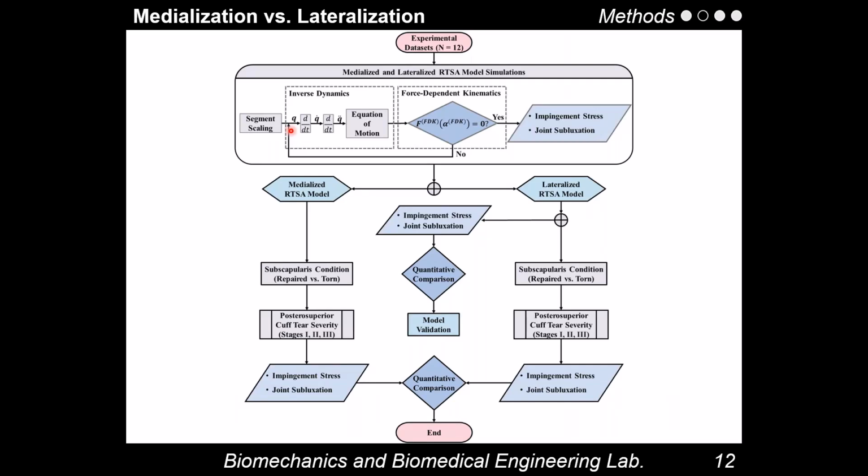Fourth, the lateralized RTSA model was validated by comparing impingement stress and joint subluxation against results from a validated finite element model. Finally, impingement stress and joint subluxation were compared between the medialized and lateralized RTSA models under both subscapularis repaired and subscapularis torn conditions across 3 stages of rotator cuff tear severity.